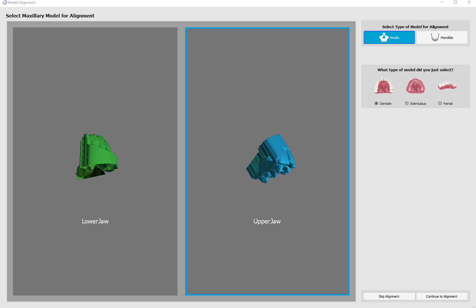The software automatically brings up the model alignment screen. Since I'm going to be creating a crown for the upper jaw, I'm going to click upper jaw, select the relevant model, go ahead and select maxilla in the top right corner, and partial, since this is a partial jaw. I'm going to click continue to alignment on the bottom right.